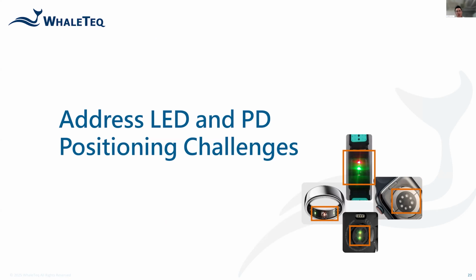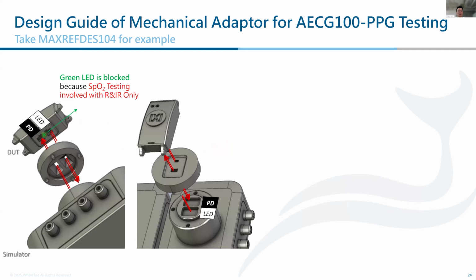Therefore, adopting the PPG sensor simulator at the moment with a simple LED-PD position starts facing challenges, because what we show you is one side LED, another side PD optics. This doesn't work for those beautiful watches or beautiful trackers. So the challenge wasn't there when all the designs were like this, LED and PD. They can go through a mechanical fixture, arrive on the PD, and the AECG will send the LED signal through the mechanical adapter back to the PD. So this PPG simulation works.